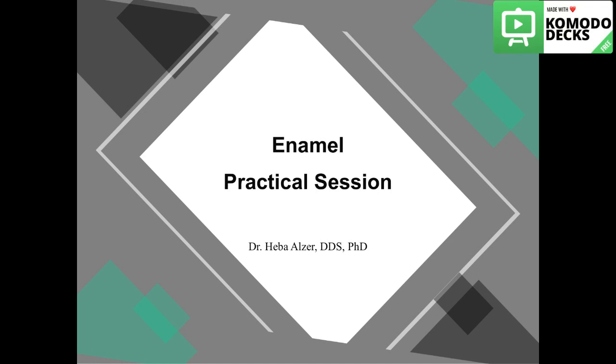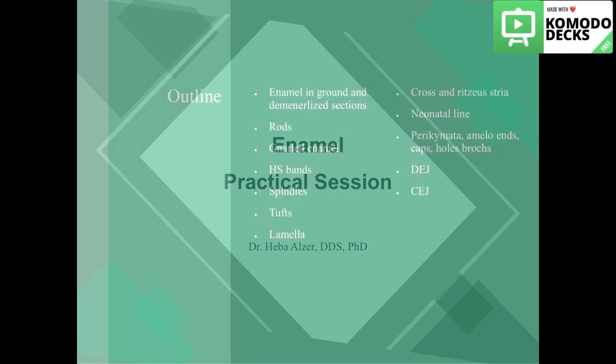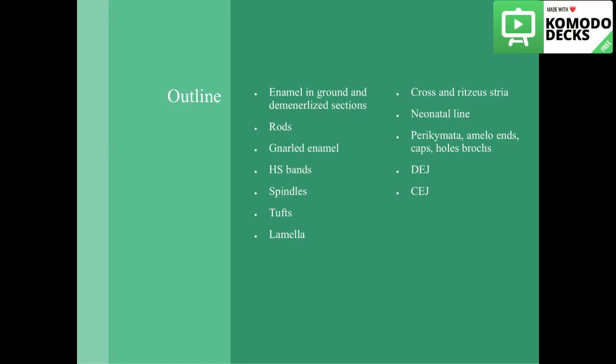Welcome to the practical session about enamel histology. In this session, we will discuss the histology of enamel in more detail, and we will see more slides to explain what we took in the theoretical lecture. We will focus on all the histological features we explained in the lecture.